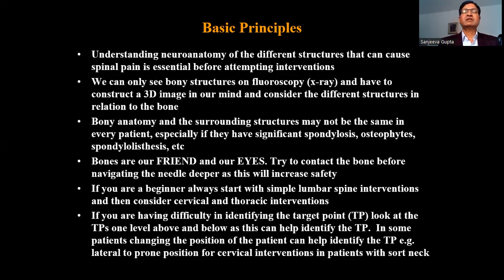Of course, if you can't see the target points at all and you're having difficulty and are not certain, at the cervical level, I think you should, even at lumbar or thoracic level, of course, but at the cervical level, you should never attempt anything unless you can see the target points. Before I do any cervical procedures, I always conduct a fluoroscopic examination, make sure I can see the target points, and only then will I scrub.